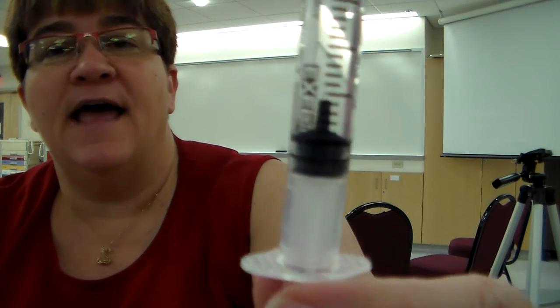And I want to push that medicine up, dispose of the medicine wherever my facility tells me to. I'm going to make sure that my plunger is on the 3, okay? So now I look and I have actually 3 milliliters, which is the correct dosage for this medication, okay? All right, so that is skill 2.22, preparing medications from vials.